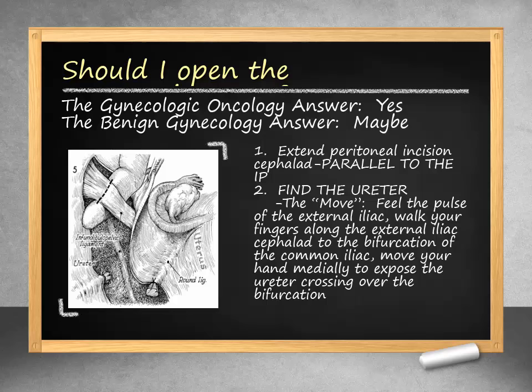Next, we find the ureter, which is located on the medial leaf of the broad ligament. This can be accomplished by identifying the external iliac artery and gently walking your fingers along the artery in a cephalad direction until you reach the bifurcation. Once at the bifurcation, moving your hand medially will expose the ureter as it crosses the pelvic rim.